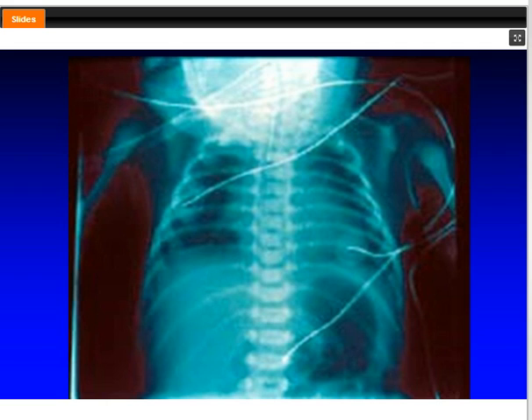adequate lung volume, you will create a pneumothorax in this baby, because notice the lung fields are relatively clear. And in fact, this baby was on a mean airway pressure of 25 at this time. But that's all the baby needed because you want the lung to be clear. So again, what does the lung look like, not necessarily how many ribs you are counting, with what's going on in the lung field. Well, what about non-uniform?